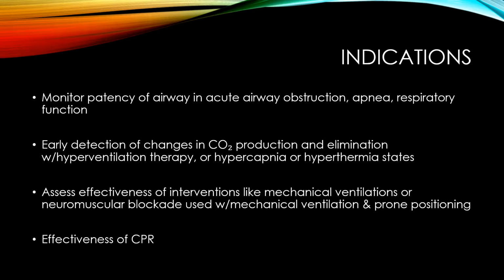It may also be used for something called hyperventilation therapy, which is done usually in an ICU department, but it is to reduce elevated intracranial pressure. Hypercapnia is a term that you will hear, and this is excessive CO2 in the bloodstream, typically caused by inadequate respirations.